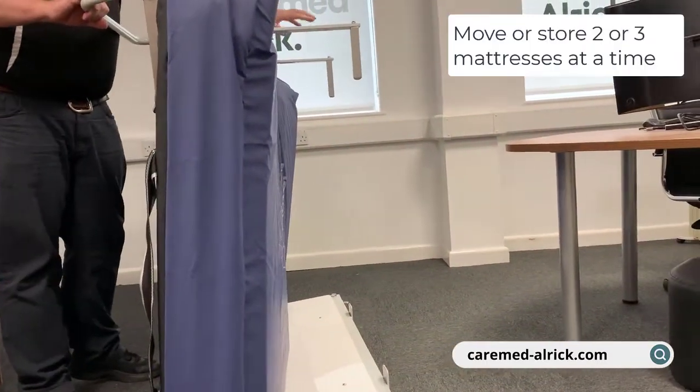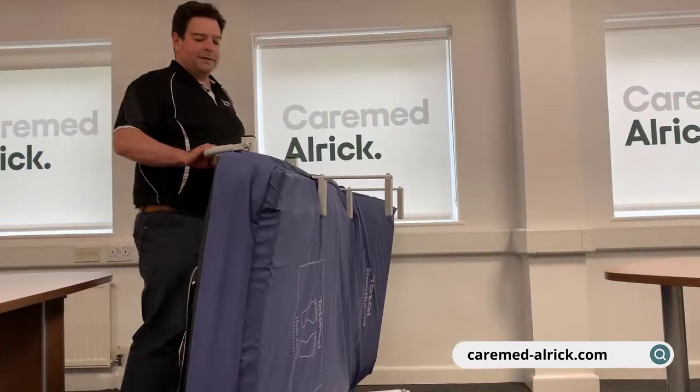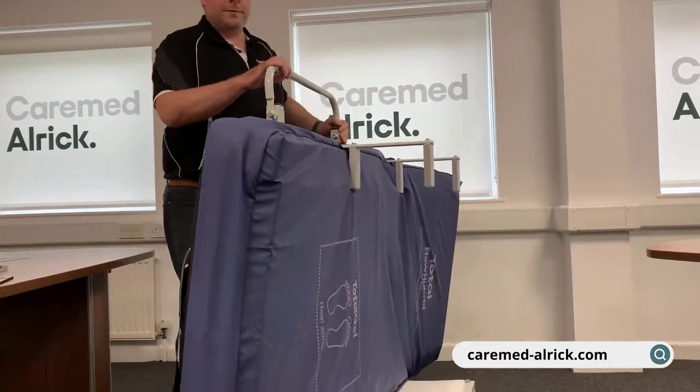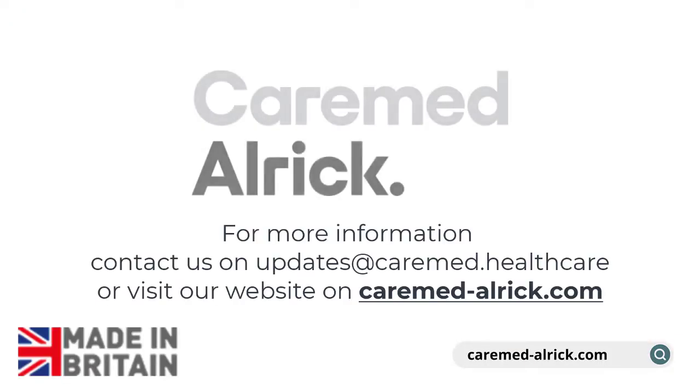We can move two mattresses, and we also do a three-mattress capacity trolley. They've got an adjustable handle, so if we're getting into a narrow space we can actually fold that up. And there we go — that is the Mattress Mover.